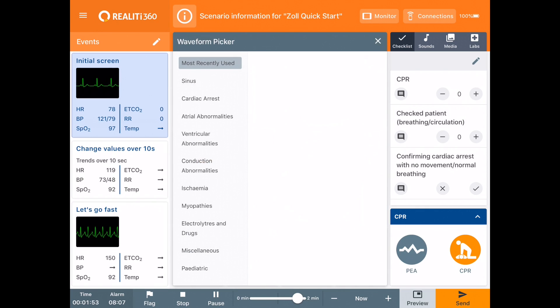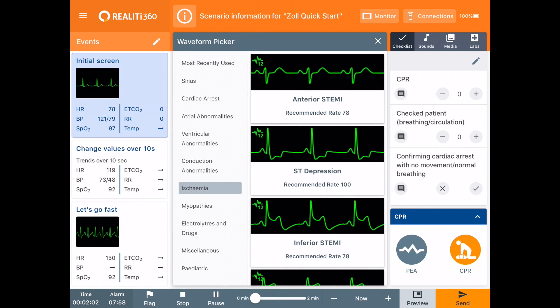You may notice that there are some additional categories that we have added, such as myopathies, electrolytes, and drugs. Let's go into one — let's pick ischemia — and now you can see that some of the ECG waveforms have the number 12 with an ECG icon next to it and a recommended rate underneath. All of these ECG waveforms have 12 leads associated with them.